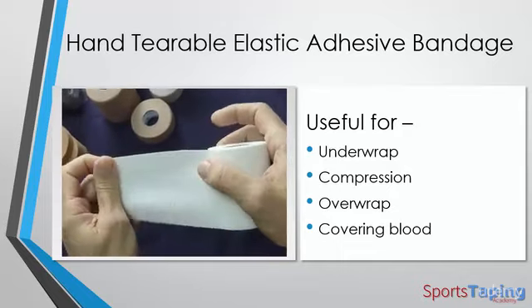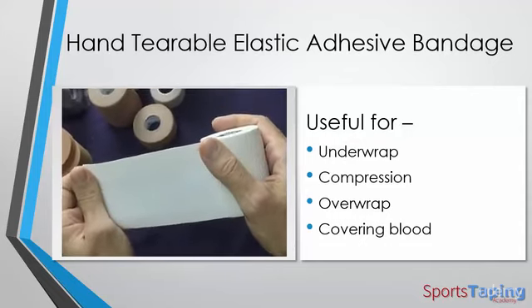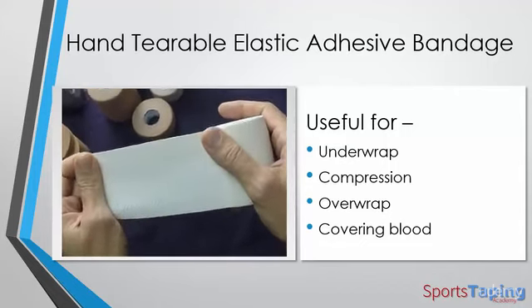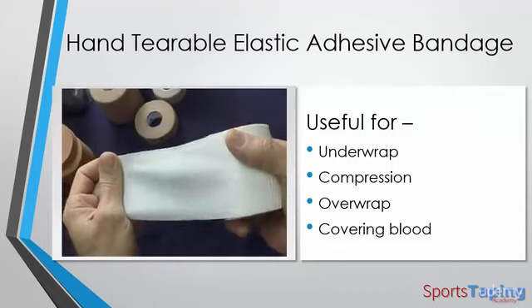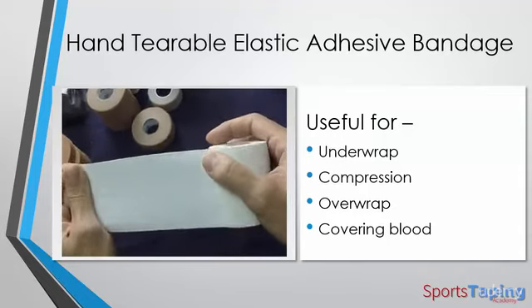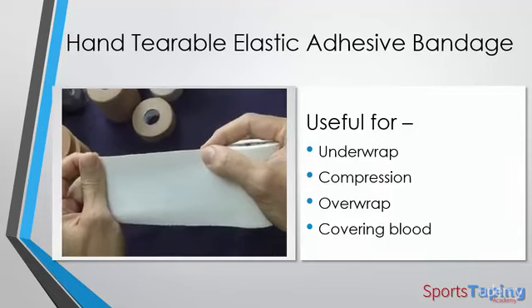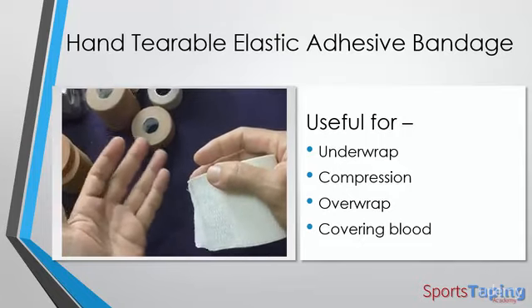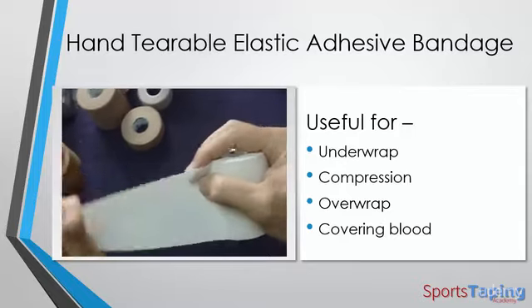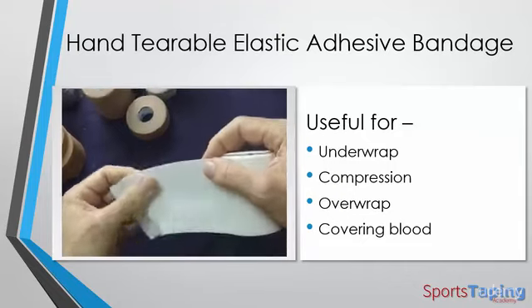It's very, very thin. So in the case of an injury, we can use this tape to compress the area, which is obviously part of the injury management. And because it's so fine, they can still ice through it, so they can keep the compression on, and they can whack the ice on over the top, and so they can still do their icing. The other thing, because it's so thin, like the EAB does conform to the contours of the body, but this one just hugs the contours of the body. It just goes around everything so well.